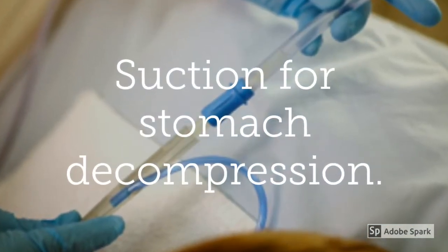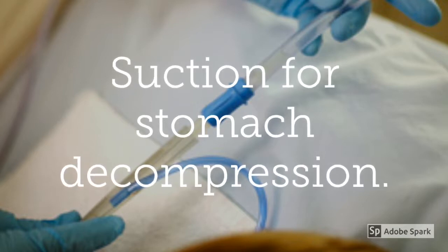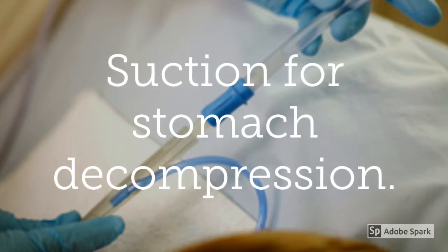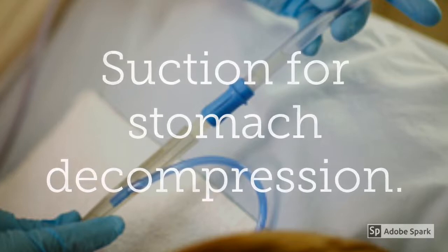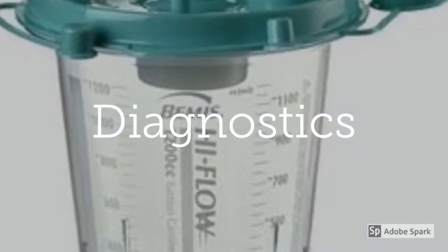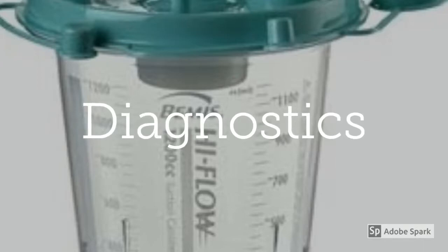Secondly, NG tubes can also be used to remove stuff from our patient. We can use NG tubes to suction content from the stomach. This can be used to decompress the stomach in patients who have intractable nausea and vomiting, or who have an intestinal obstruction. Additionally, the stuff that comes out of that tube can be important diagnostically. We and the doctor can use the output of an NG tube on suction to evaluate upper GI bleeds.